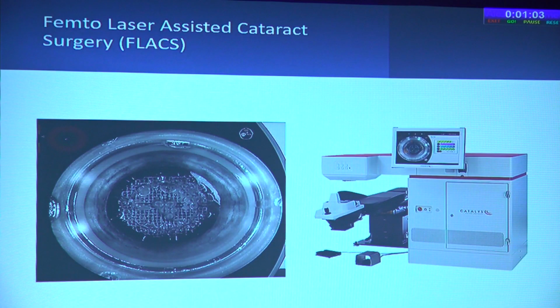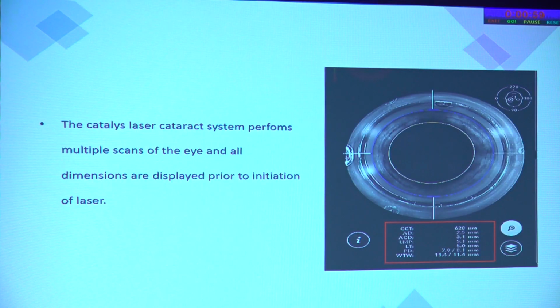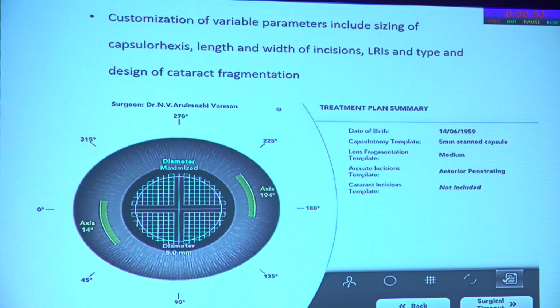The next technology I wanted to speak about is a femtosecond laser. So as you know, this also uses a type of imaging. It's an OCT based imaging and performs multiple scans of the eye, and all of the dimensions are displayed prior to the initiation of the laser. You can go ahead and do your LRIs, you can do your incisions, your rexes, and your nuclear fragmentation patterns as well, all of which can be modified according to the surgeon's preference.